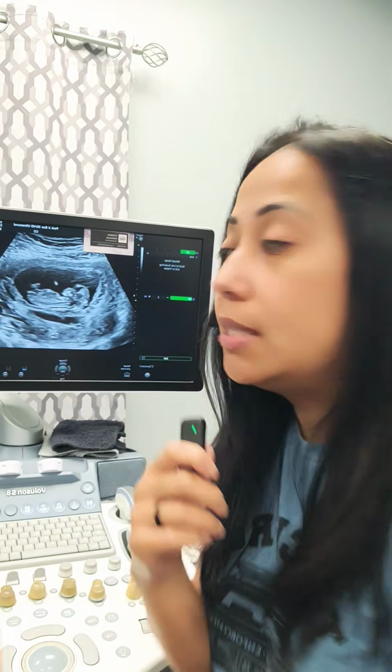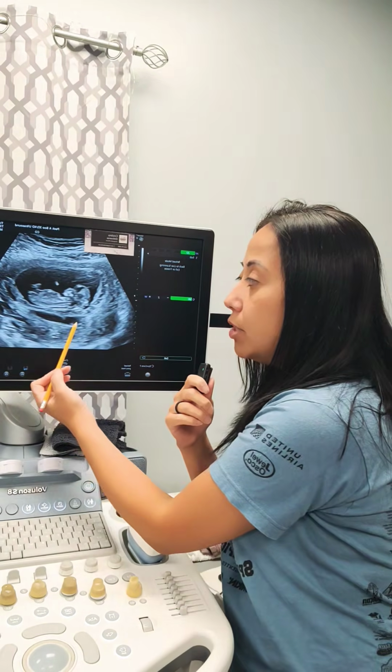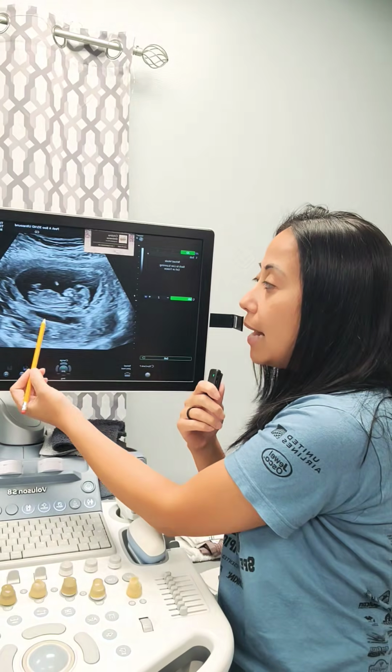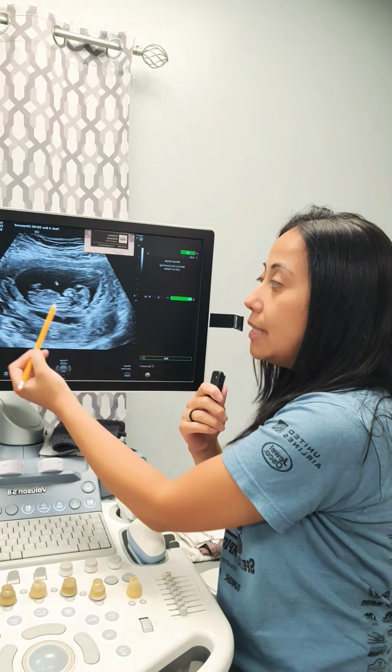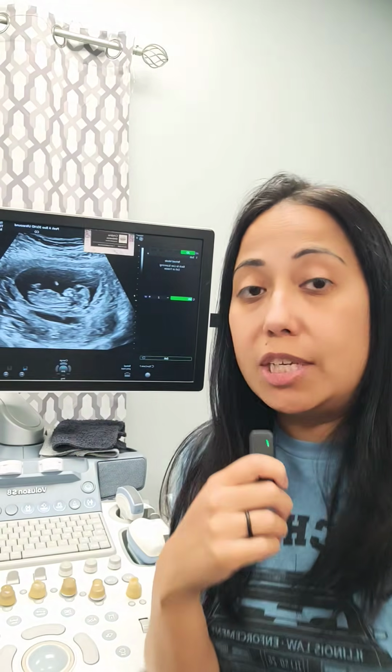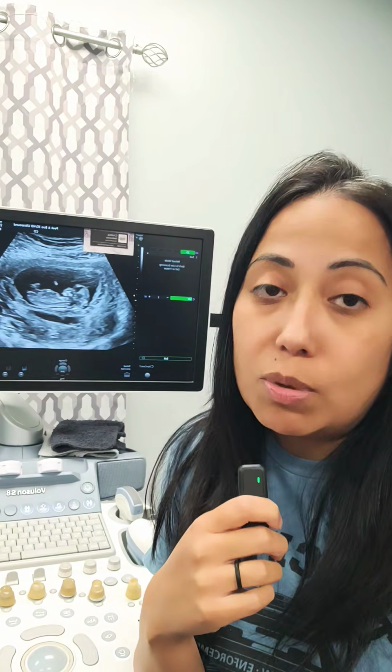In the example behind me, I would consider this subchorionic hemorrhage or implantation bleed to be small because when you look at it, when compared to the pregnancy, this is a lot smaller than the big gestational sac and the baby that is within the gestational sac.